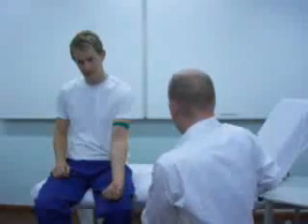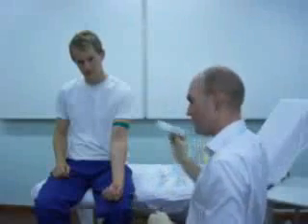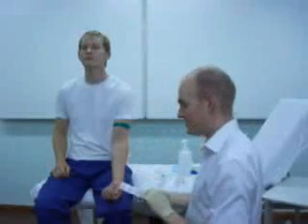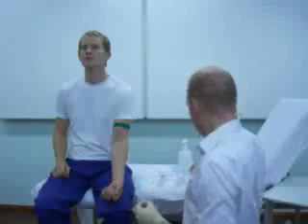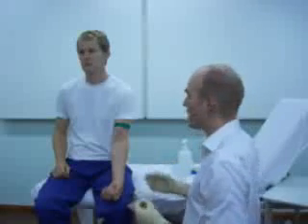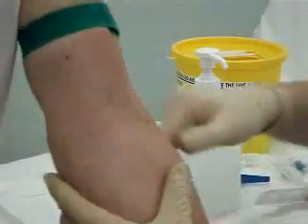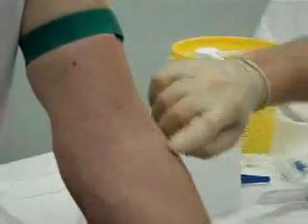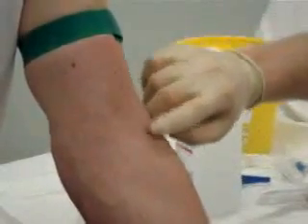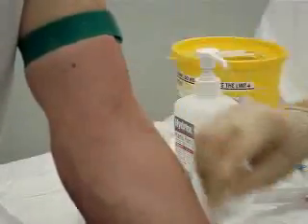Okay. Now you can select any one of a number of different venflons. I'm going to use a pink, and you can see separately on the site about different sizes of venflons and what they mean. Essentially, blue is the smallest venflon, then pink, then green, then white, then brown being the largest venflon. Again, you can see in Ben's arm, very nice vein coming down here, very easy to palpate when you do that. So again, just re-clean this site.